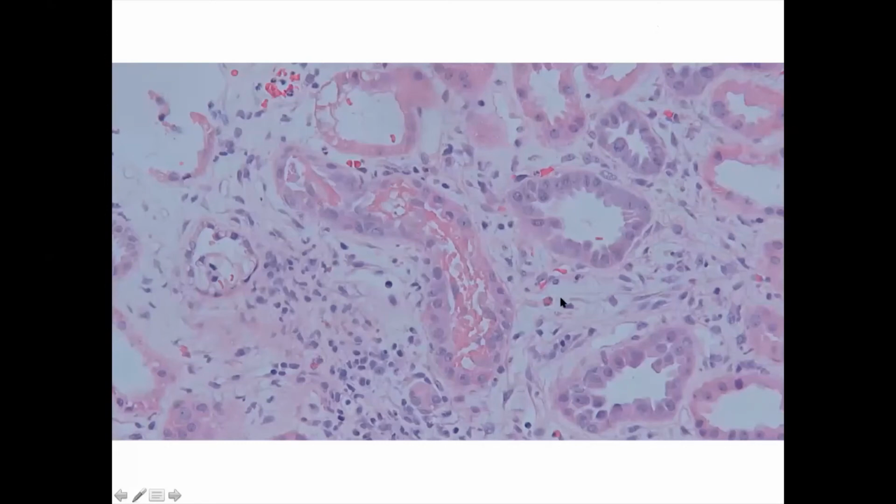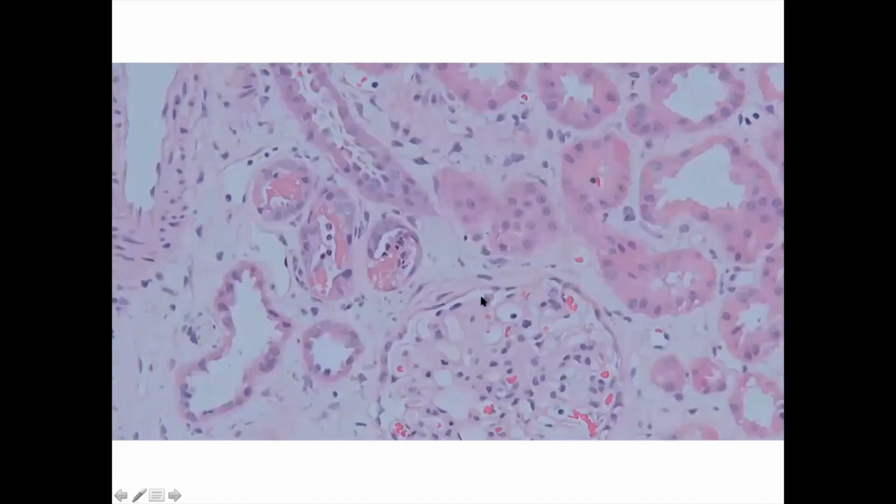Right, okay. فكان عندنا هادلين الcasts and let's see how these casts look على different stains. هذه الأكيها الجلوميرولس حلاوتها ما فيها شيء absolutely fine. And like I always told you guys, best إن إحنا we يعني judge the thickness of the glomerular basement membrane, الميزانجم, all of that على special stains. لأن على ال H&E الميزانجم can appear as if it is thickened أو ممكن يكون عندنا apparent mesangial hypercellularity.